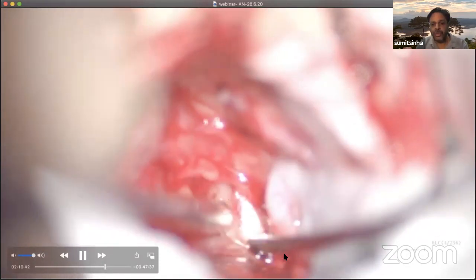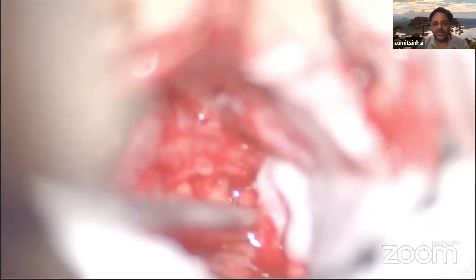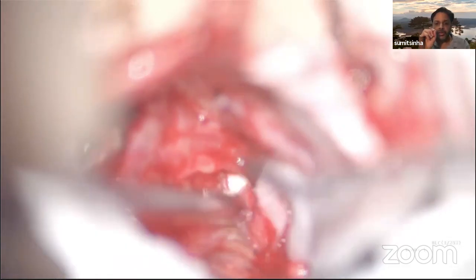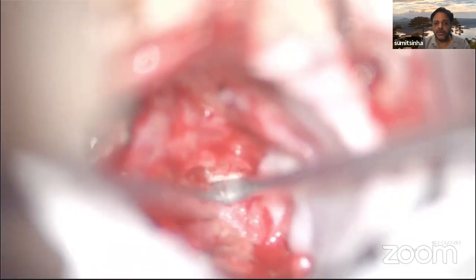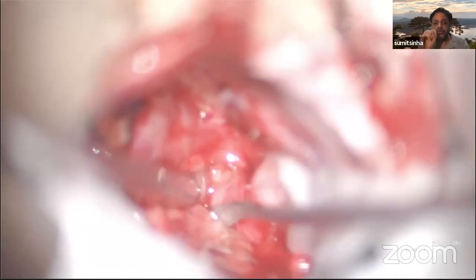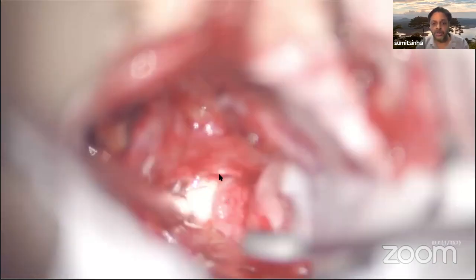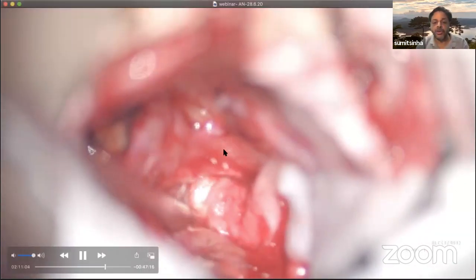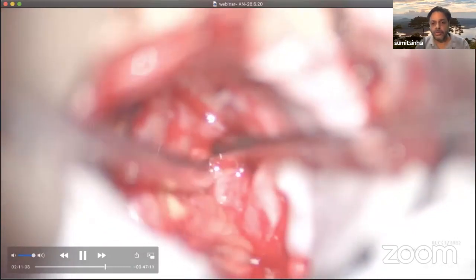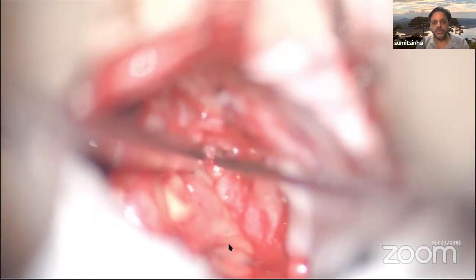So you have to be very cautious while separating the facial nerve. My hypothesis is that facial nerve injury is very prone to happen in acoustic neuroma surgery, because the nerve is not protected by an arachnoid plane. The seventh-eighth complex is not protected. You see the arachnoid is outside the facial nerve, and nowhere between the facial nerve and the tumor capsule does the arachnoid come. So you have to take this anatomical concept clearly in your mind if you want to save the facial nerve.